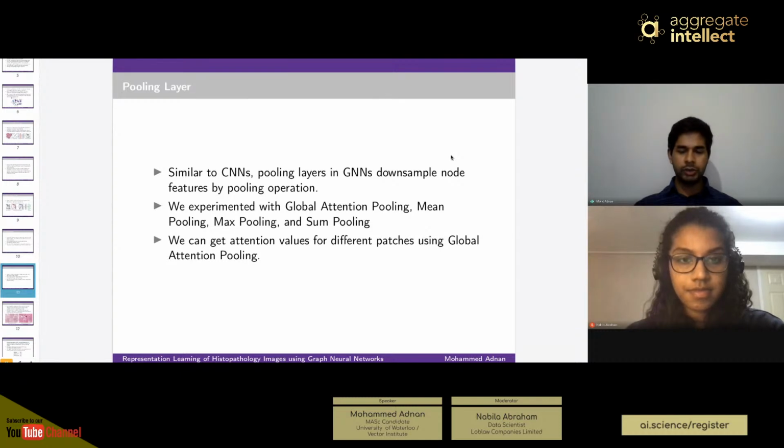So this is very useful for pathologists. Especially right now, pathologists are very reluctant to use deep networks because they are kind of a black box. But this approach can tell the pathologist, okay, this patch is more important because it has a high attention score. So this is a more transparent way to do classification, and inference is very easy using this kind of network.